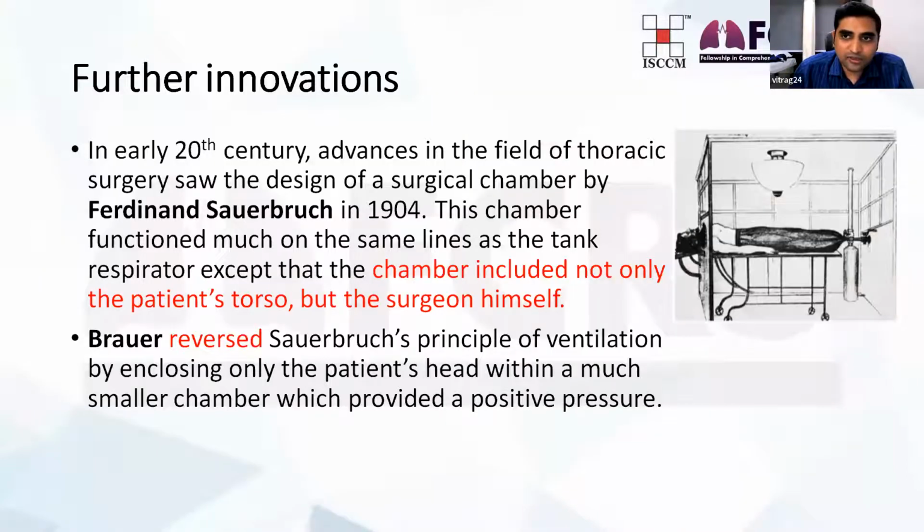So, further innovation in the early 20th century: advances in the field of thoracic surgery saw the design of a surgical chamber by Ferdinand Sauerbruch in 1904. This chamber functioned much on the same lines as the tank ventilator, except the chamber included not only the patient's torso but the surgeon himself as well. You can see the picture on the right side. So the surgeon could come inside and stand beside the patient, but the head was outside this chamber.